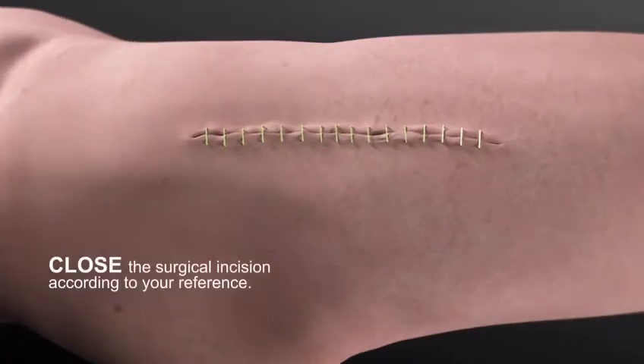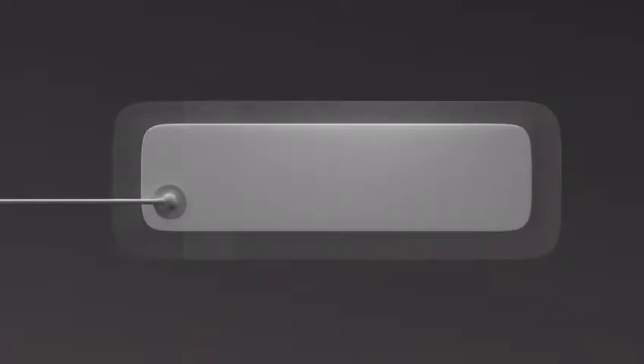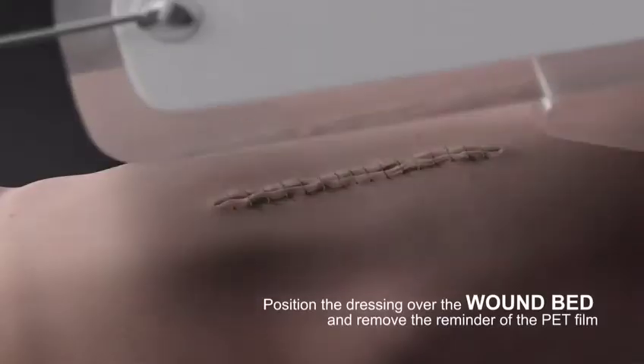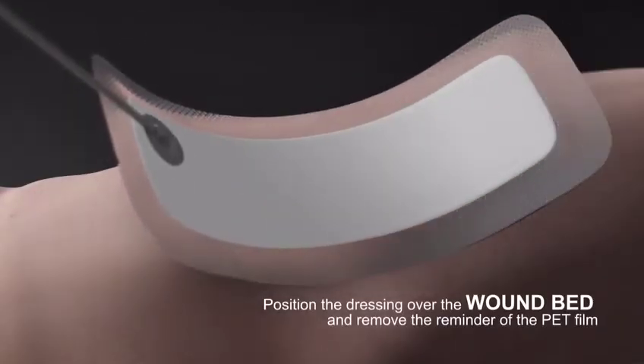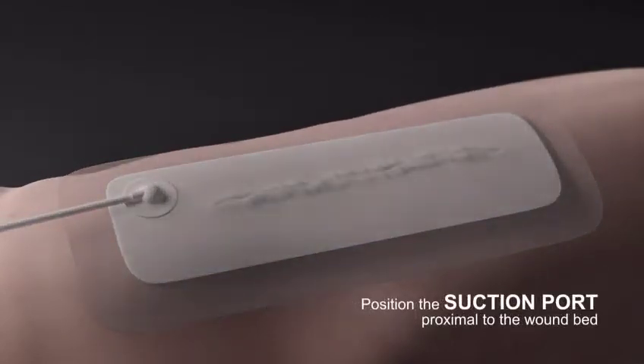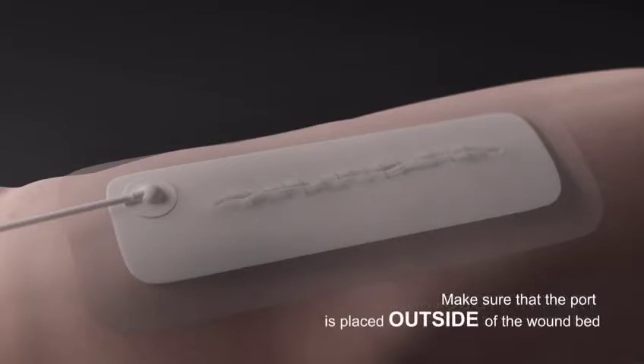Close the surgical incision according to your preferences. Remove the PET film partially from the dressing. Position the dressing over the wound bed and remove the remainder of the PET film. Position the suction port proximal to the wound bed, making sure that the port is placed outside of the wound bed.